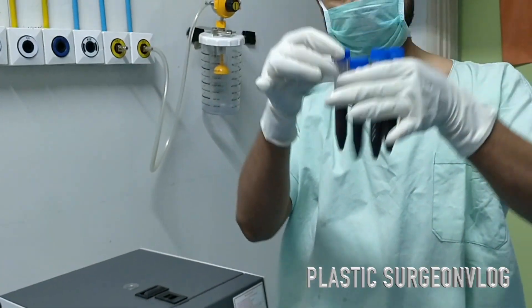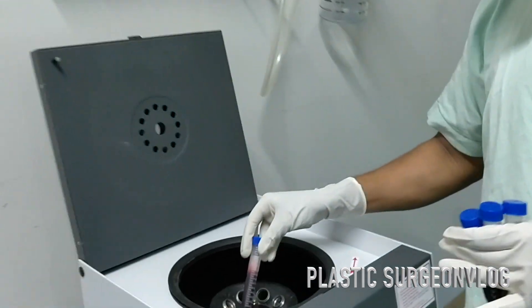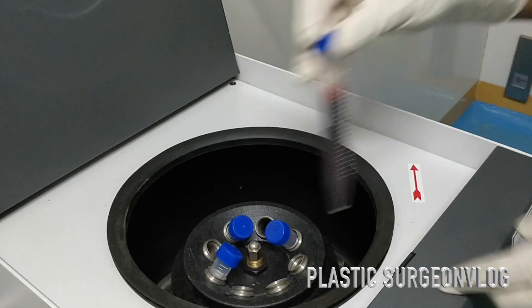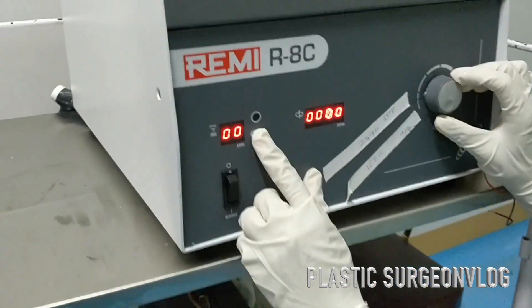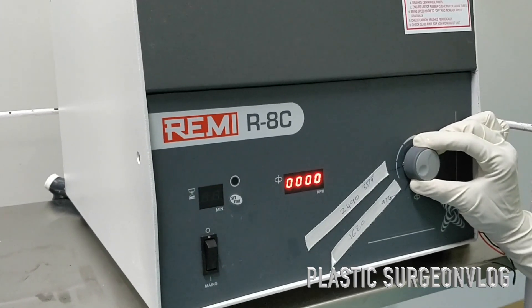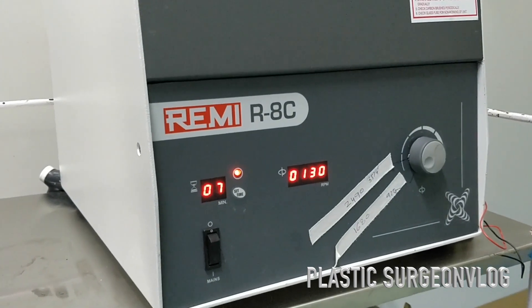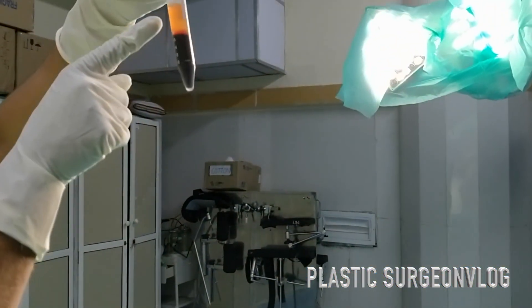Now I am putting these test tubes in the centrifuge machine and performing the first spin at a specified rate to separate RBCs from the plasma. This process is called the first spin or soft spin.